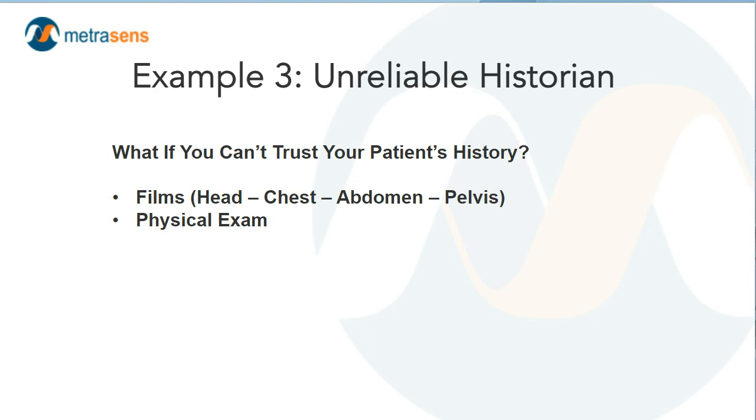So we won't do it as a poll question, but I'll just put the question to you to mull over. How do you handle patients with language barriers, altered consciousness, patients who you have reason to suspect are not being fully forthcoming about their clinical history? What is your process? How do you go about trying to identify questions or concerns to be able to resolve? Or do you not try and identify them?